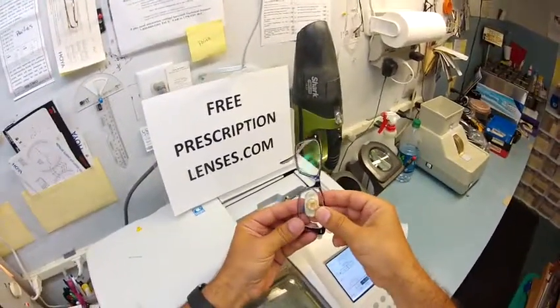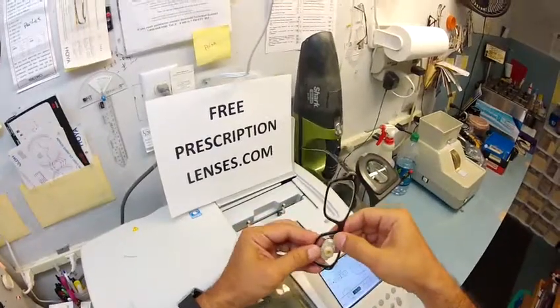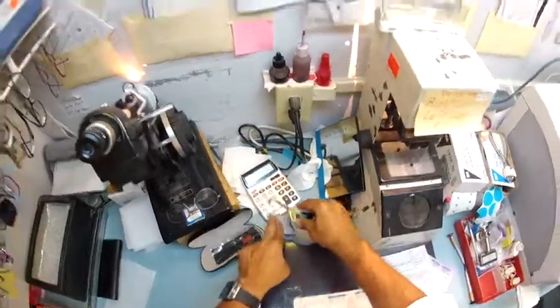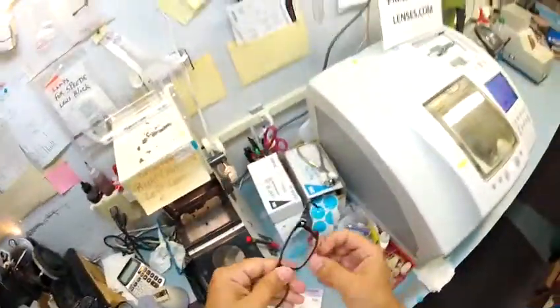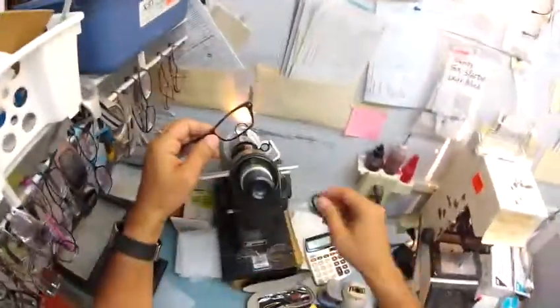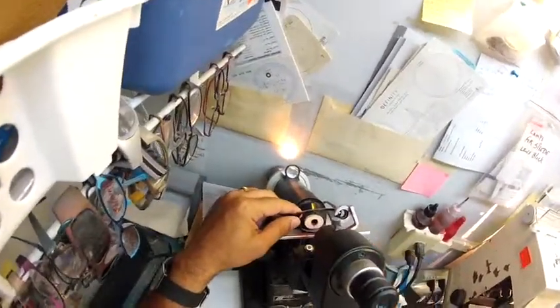All right, so to see if your left lens fits, I'm going to tuck it in at the outside corner. Then using my thumbs, I press down at the nose, and it snaps in. I'm going to take this block off. Take this blue sticker off. It is no longer needed. Drop that, and oops, fell on the floor too. See, that's what I get for trying to throw something away. It still falls on the floor.